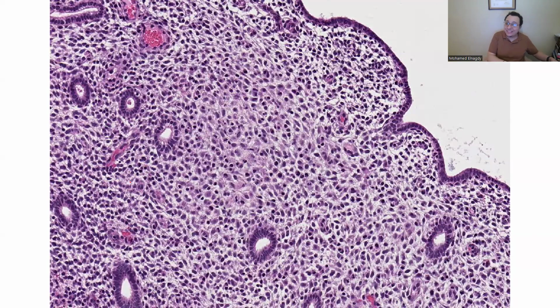You know what? That's a good mistake. It's a mistake, but I appreciate it. Maybe atrophic something, I don't know. Why? Because you focused on the glands, and you see the glands are not dilated. Yes, this is proliferative. But let's say we went high power, we didn't see any pseudostratification, we didn't see any mitosis, we didn't see anything. Actually, they're atrophic, widely spaced glands. So what do you need to look at right now?